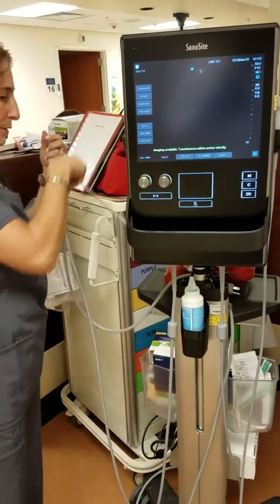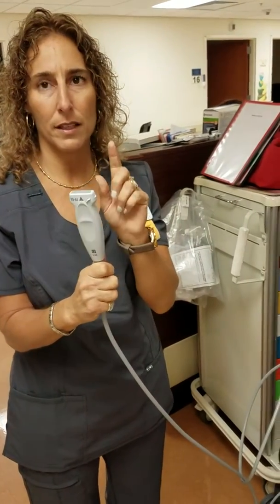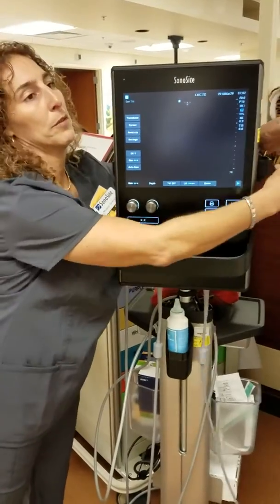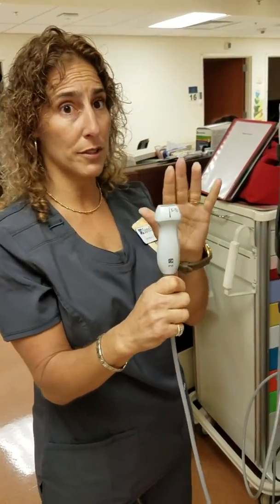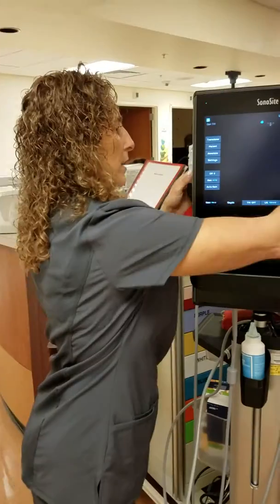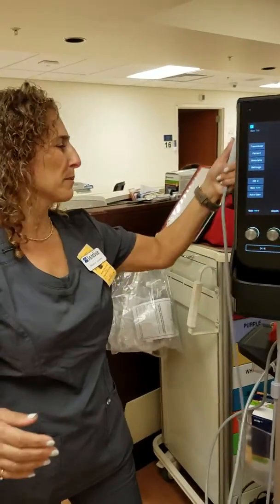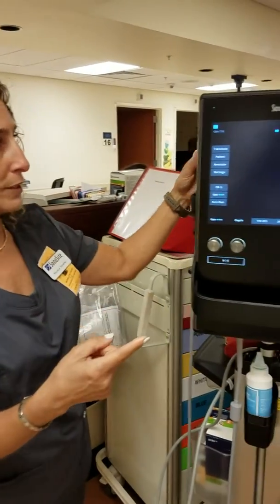You have two different transducers. This one is for vascular access and superficial structures, and this one is for abdomen, FAST exam, cardiac, and any deep structures. This one goes down to 35 centimeters deep and goes from 1 to 5 megahertz. The other goes from 6 to 13 megahertz. This is your linear transducer, and that is your phased transducer.